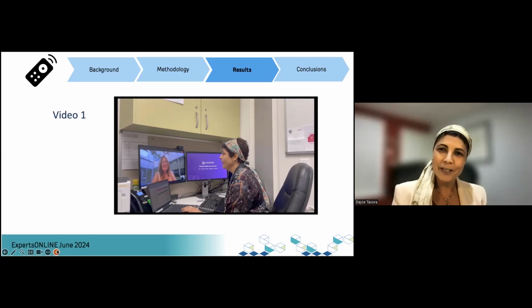It's not live, as Alex said, it is still in the cloud, but the time it takes to do the whole process is much shorter than the traditional remote mapping, because we don't have the issue of connecting the equipment and having somebody available to be with the patient. So it actually works much better for us. What I'm going to do is share with you one patient, because that gives you an idea of how it works. With this first patient, we wanted to make sure that it was working and reliable.